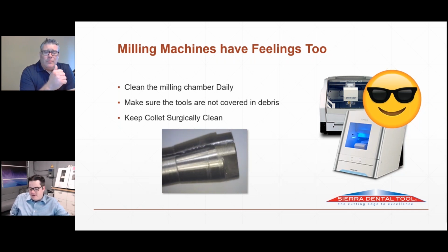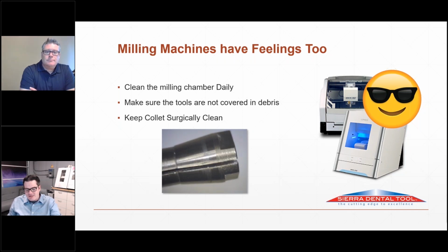Yeah, well, and if you're a lab owner or you're the guy paying the bill on the machine, it's about protecting the investment, because as we all know, zirconia powder is abrasive, and you might not think about it, might not be intuitive, but as that zirconia powder gets packed into the bearings, packed into the ball screws, the collet, all the little components of the machine that are moving, it causes them to wear out.